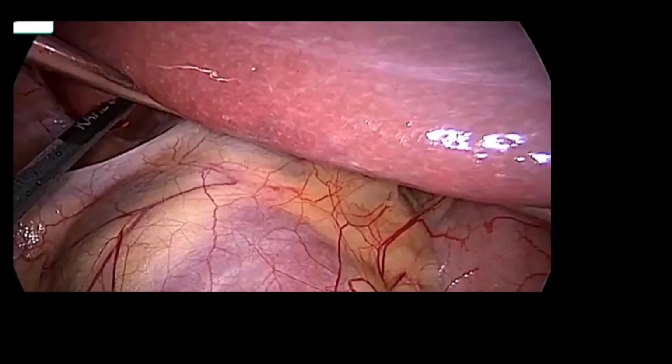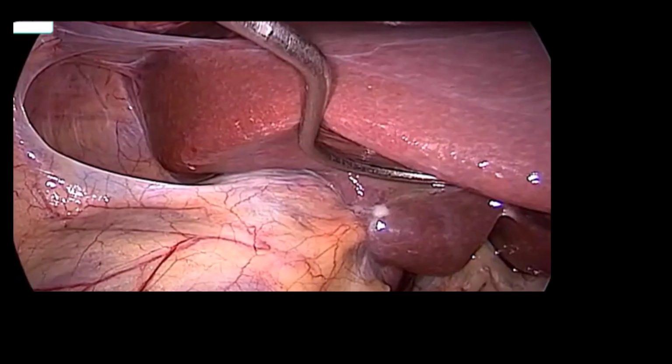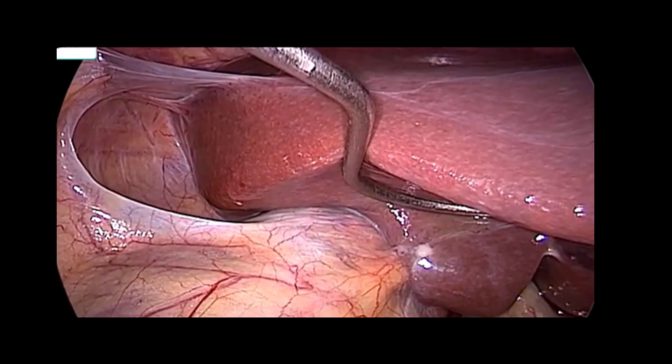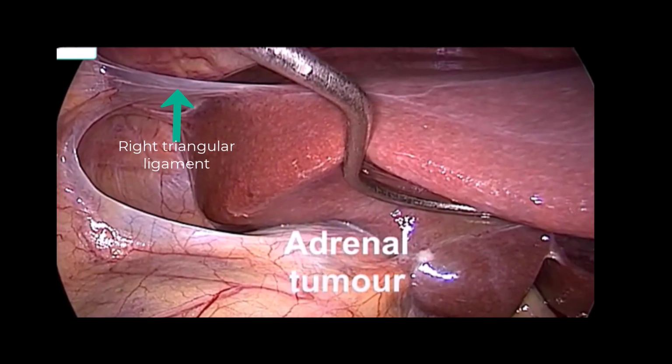First up, the Nathanson retractor that so many of you are familiar with. I'm not a big fan of this retractor when surgeons use it to simply lift or elevate the right lobe of the liver off the retroperitoneal contents. I don't think that it's nearly as safe as mobilizing the right lobe, which gives excellent access to the adrenal gland and most importantly the vena cava.